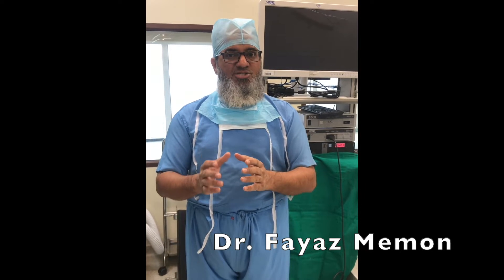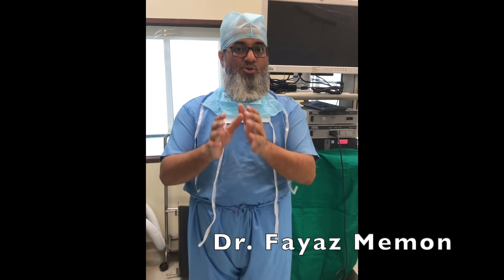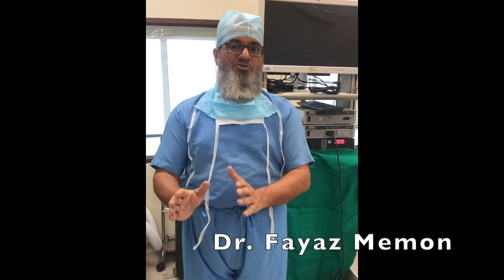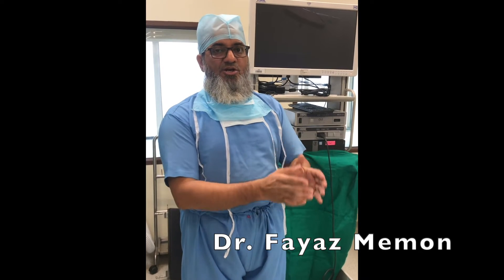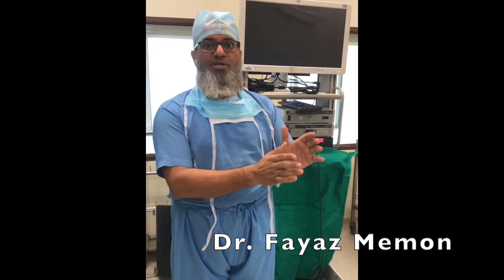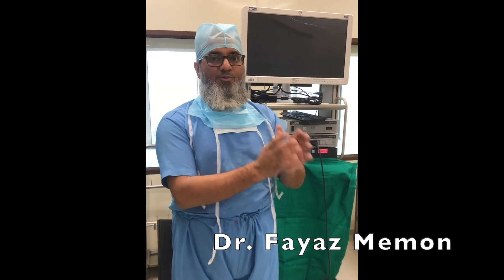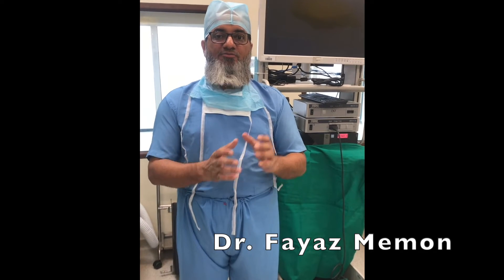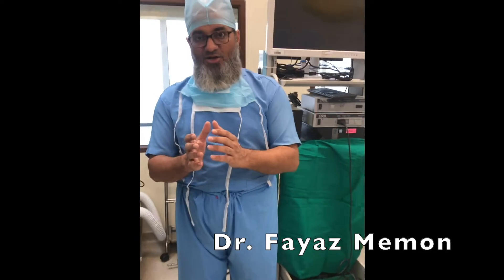There are several sliding knots described, but if we teach you more than one you are going to get confused. So I am going to teach you only one sliding knot, and that one sliding knot is going to be sufficient for all your arthroscopic surgeries. Similarly for the stationary knot, I am going to teach you only one. Remember: a sliding knot cannot be substituted for a stationary knot, however a stationary knot can be substituted for the sliding knot.